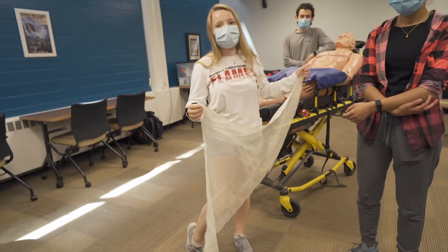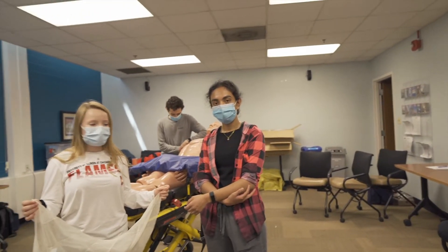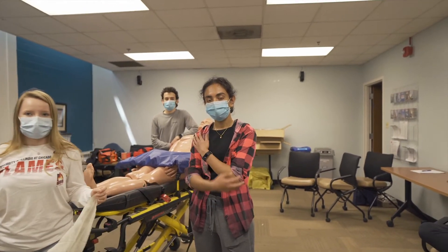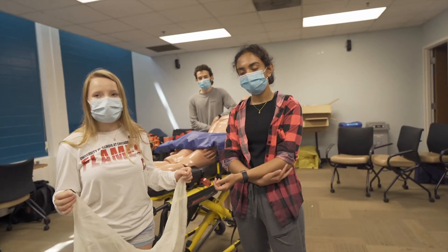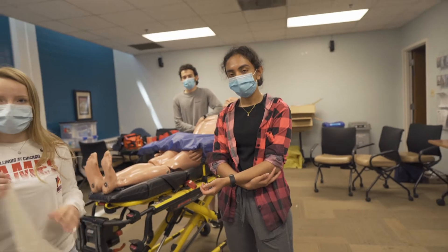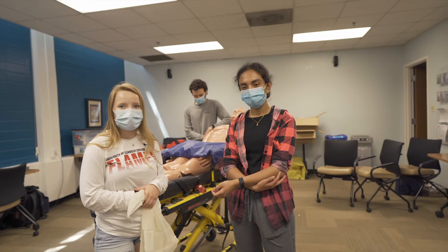The sling and swath is going to be utilized for injuries that have affected the shoulder, an arm, an elbow, a wrist, the hand. The sling provides some type of support so the patient can easily rest their arm in that sling.